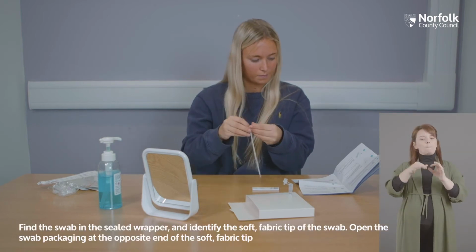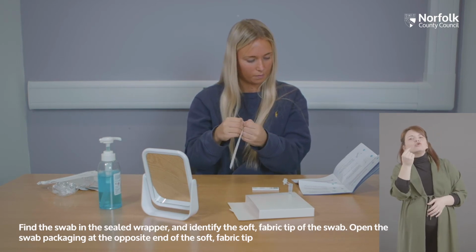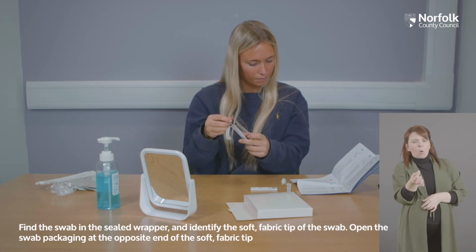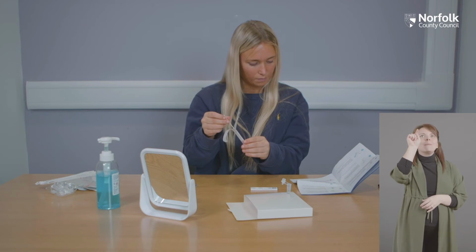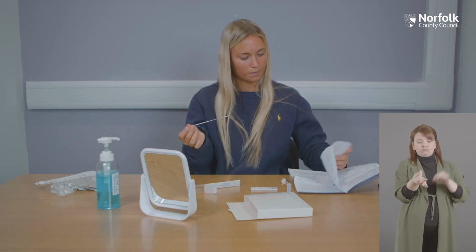Find the swab in the sealed wrapper and identify the soft fabric tip of the swab. Open the swab packaging at the opposite end of the soft fabric tip. Do not touch the soft fabric tip of the swab.